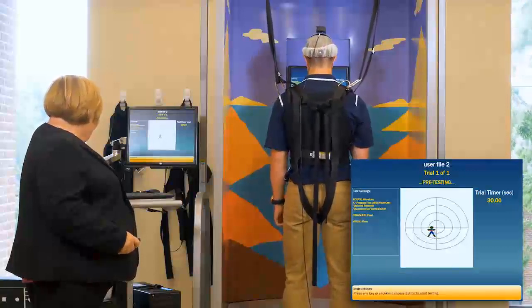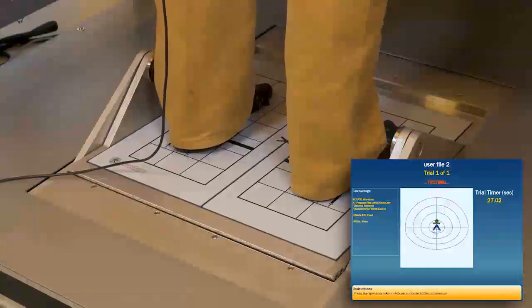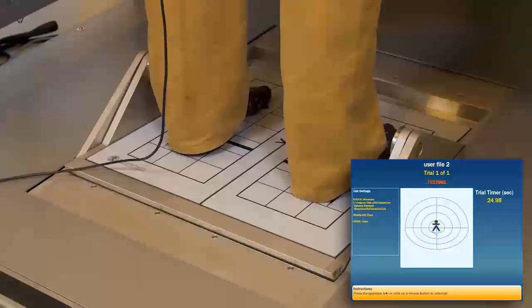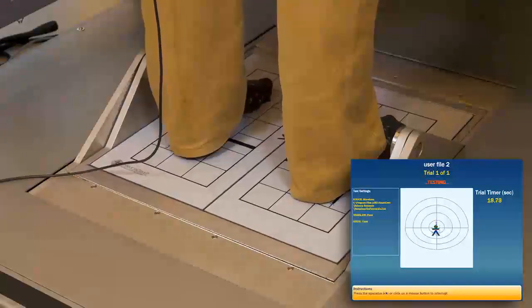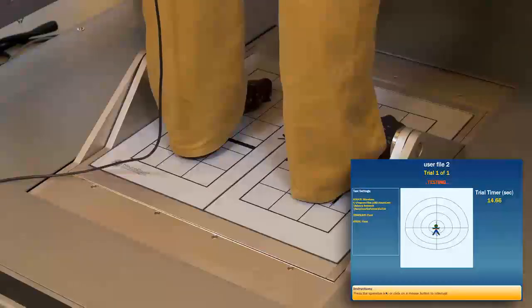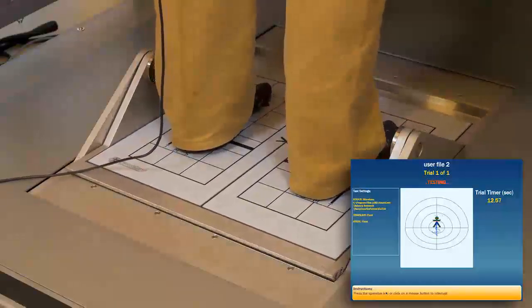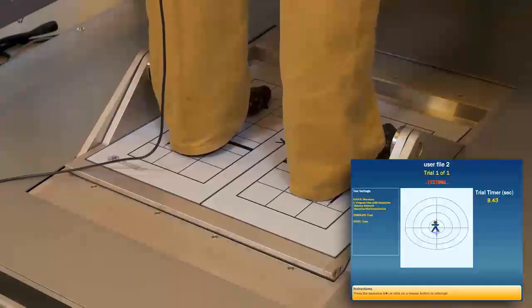Okay, and here we go. And where we're really going to see this is when we look at the motors, all right? But it may be more important to your research to have it really smooth or to have it really fast and accurate to velocities. And so they've actually given a really nice capability with this.